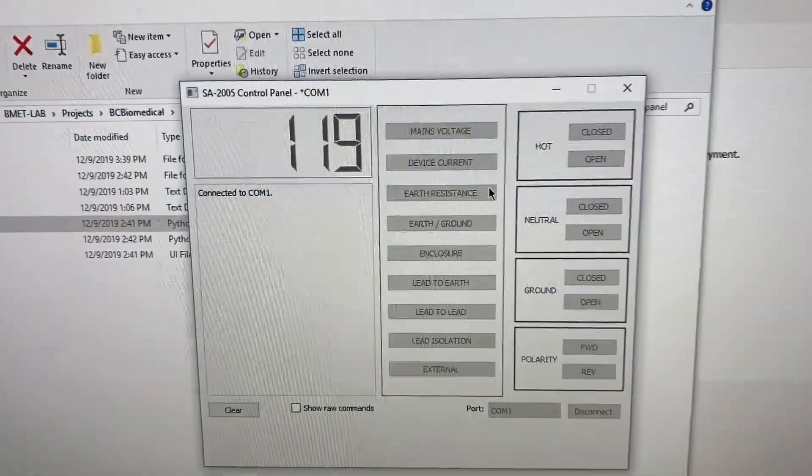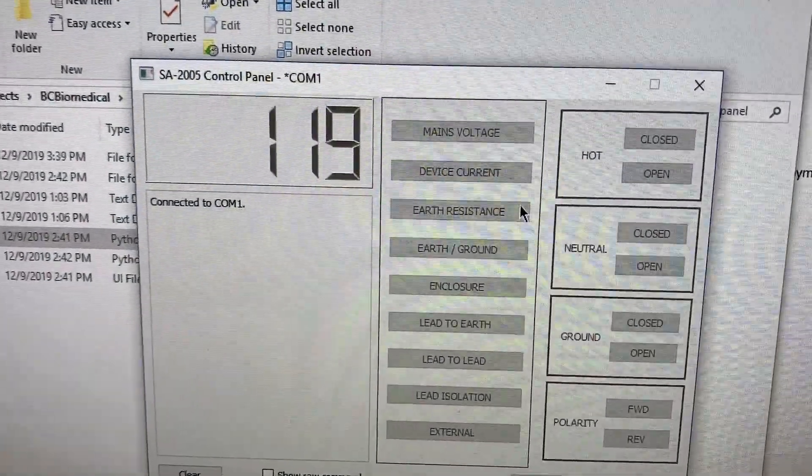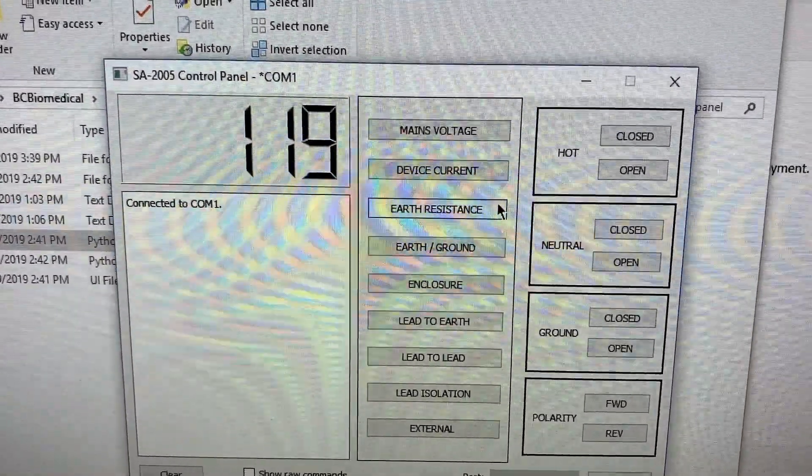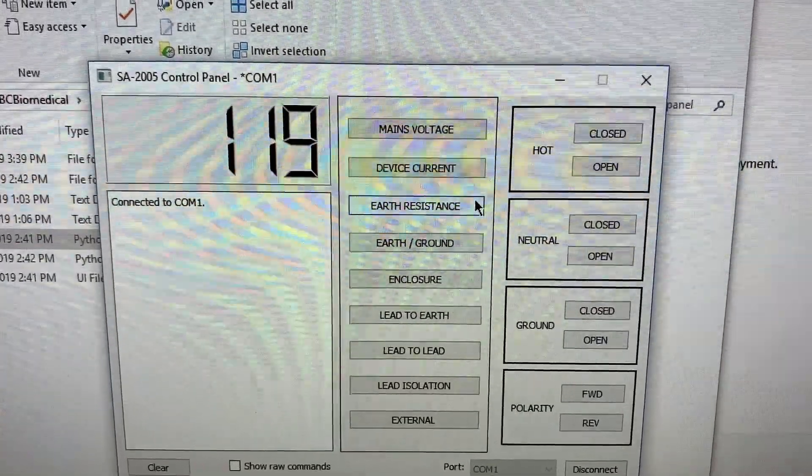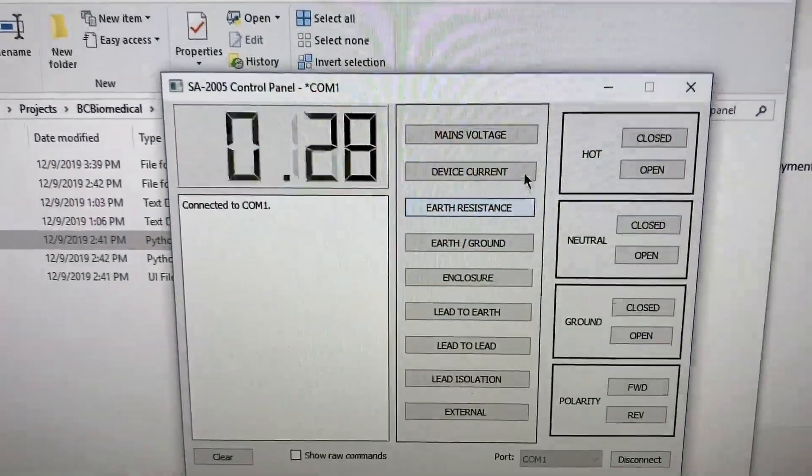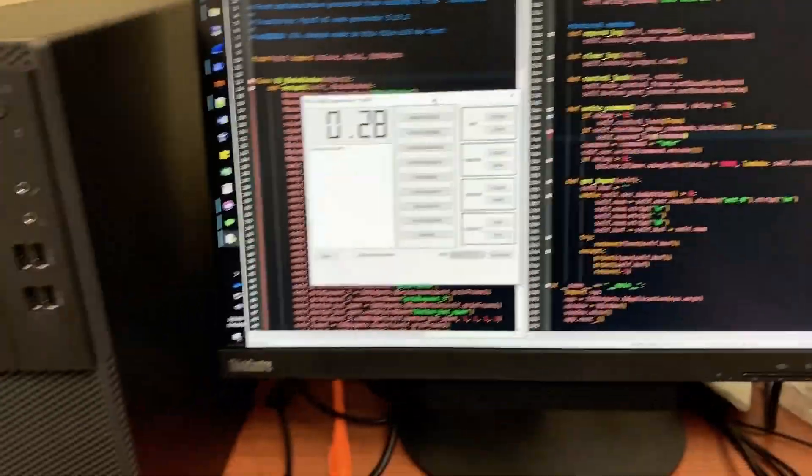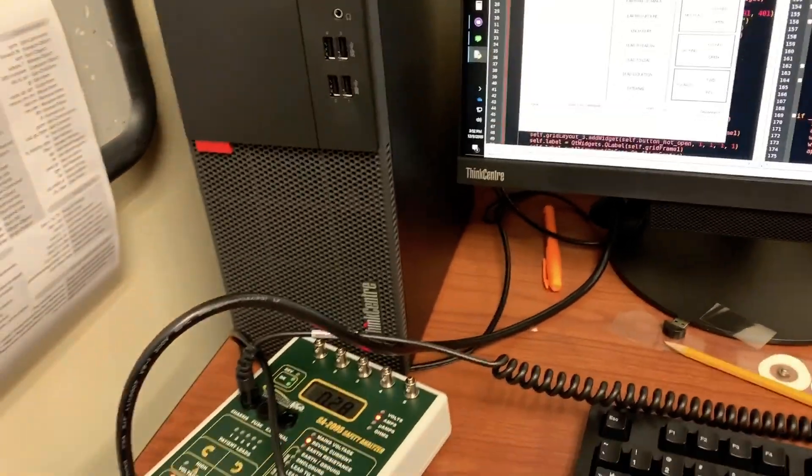One disadvantage is that it has a fairly slow update rate in terms of the values being received and the commands being sent.